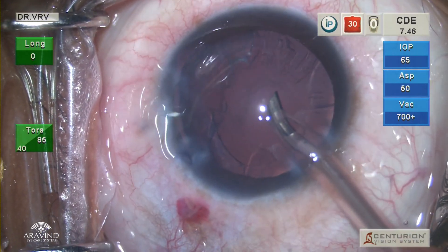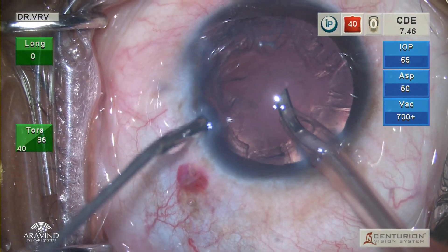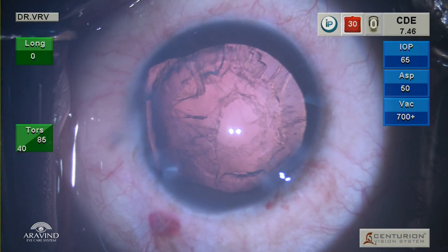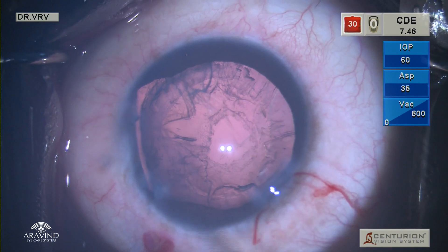First remove your second instrument, then inject viscoelastic through the paracentesis, fill the anterior chamber, and gently withdraw your phaco probe while in foot pedal zero. It is very important to have proper hydrodissection in such cases as the cortex can be very sticky and aggressive maneuvering can result in worsening of the zonular dehiscence.